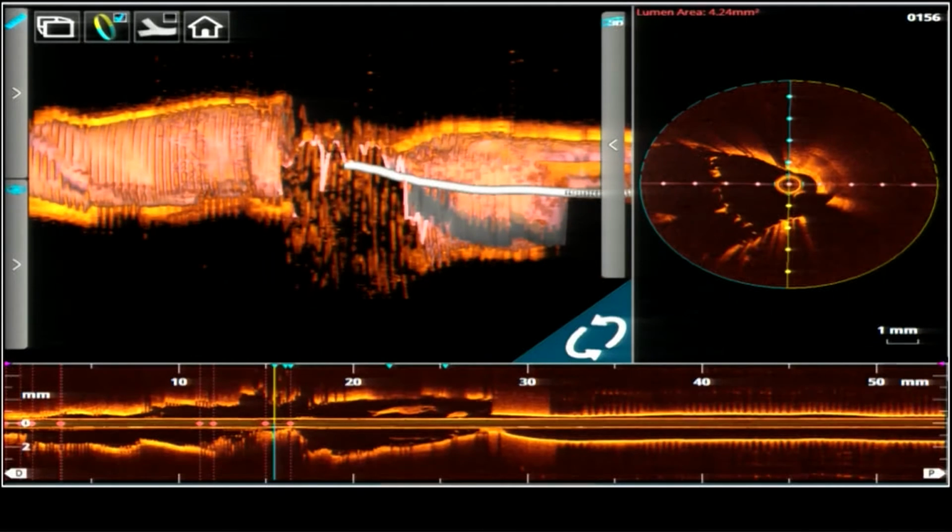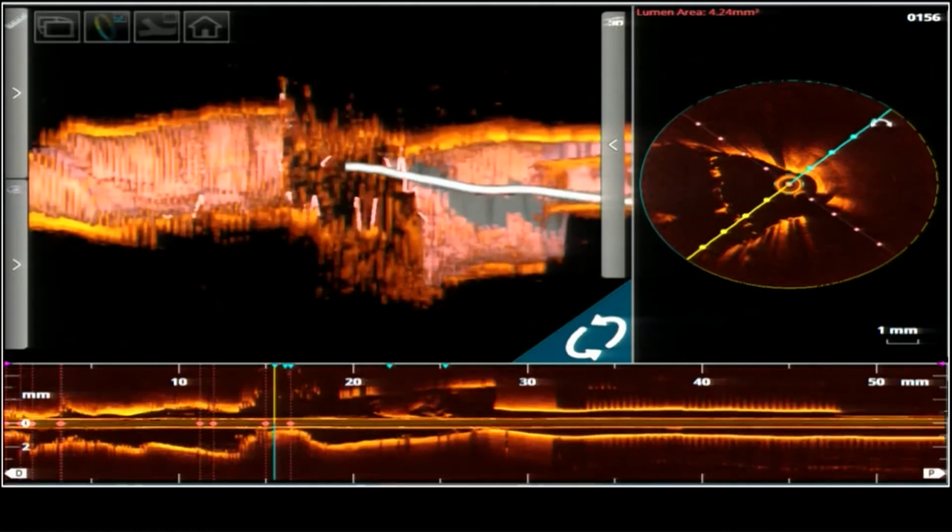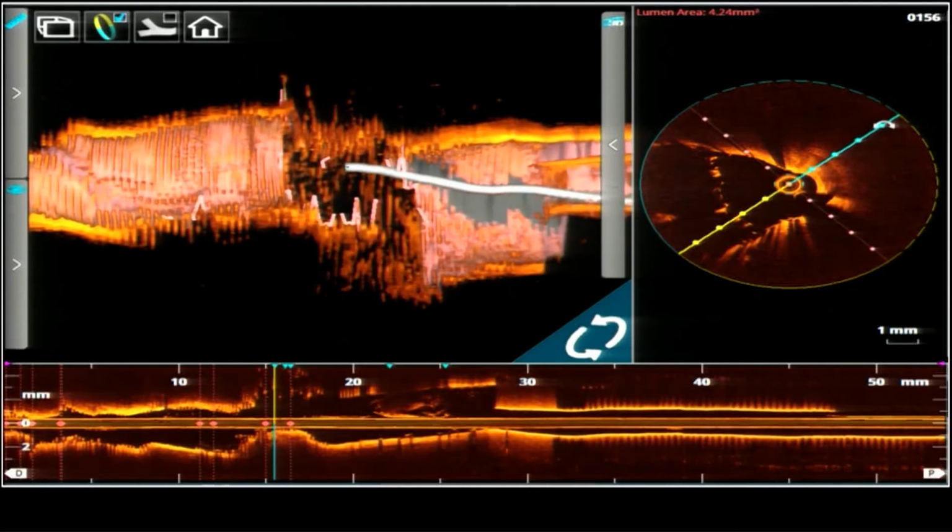The problem might be that whenever we are doing a DK crush and you have imaging, you should do OCT at least 3 or 4 times. Basically, when you cross in an ideal cell, your final outcome will be better.